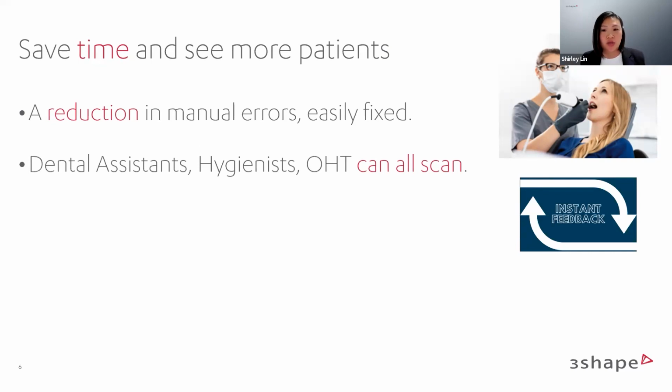And even if you just want to do some of those simpler ones where it doesn't need checking the prep areas, you can get your dental assistant to do a retainer scan. Those are quite easy. You can just do a scan of the upper and double check it with them. And then you can spend more time again seeing more patients when you are moving those simpler tasks of impression taking to an assistant or a hygienist or an oral health therapist.